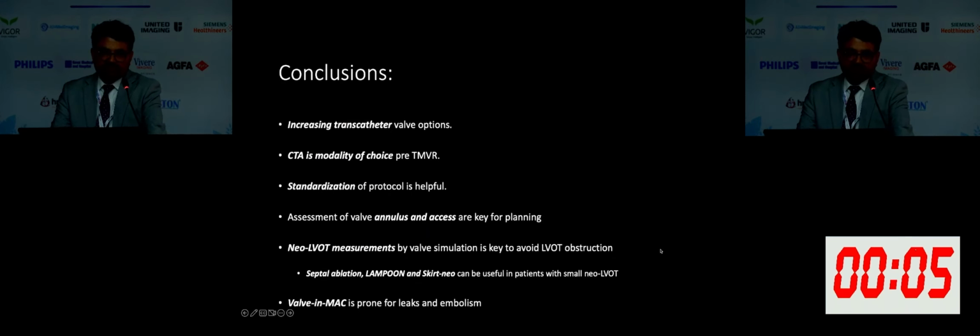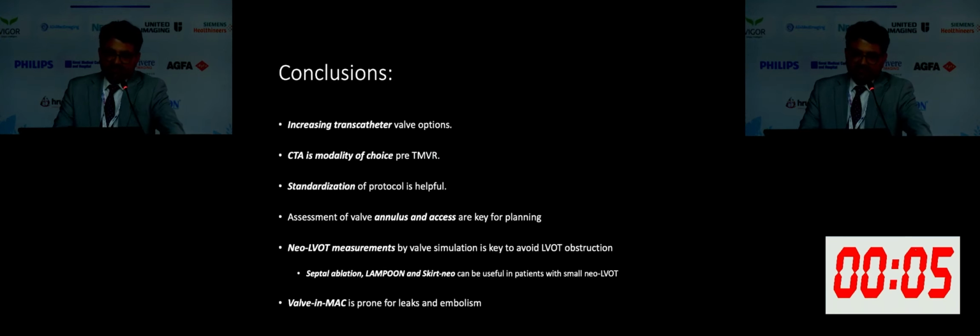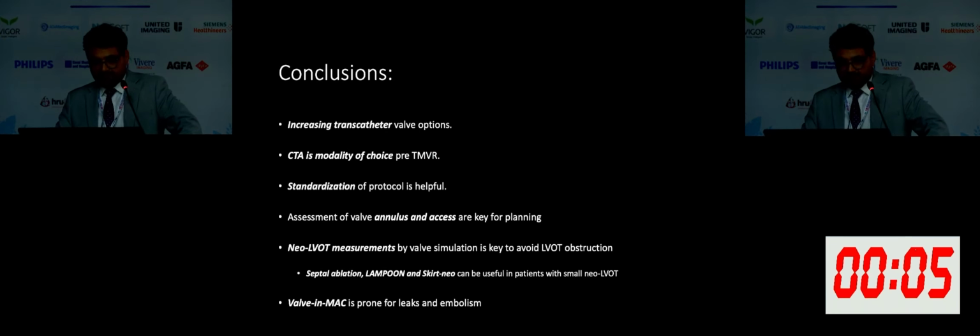All right, so conclusions. As we know, there are increasing transcatheter valve options for not only mitral, but all the valves. We need to be aware of these procedures and understand our role in them. If we speak about TMVR, CT is the modality of choice, as for all the other ones, and standardized imaging protocols are helpful.